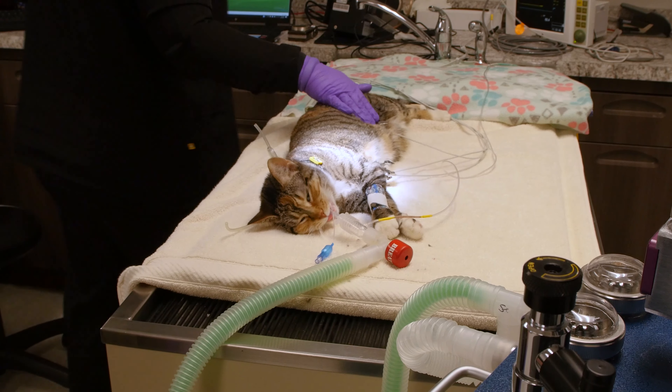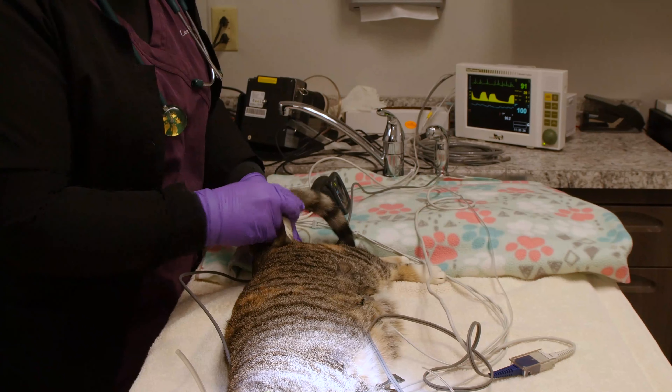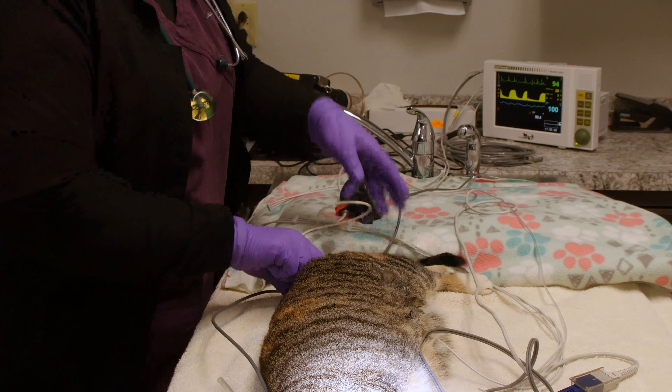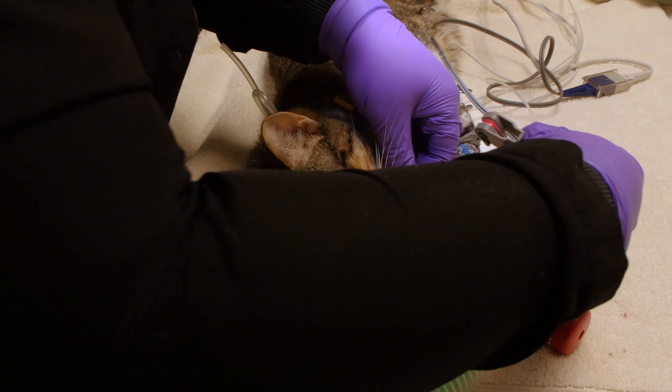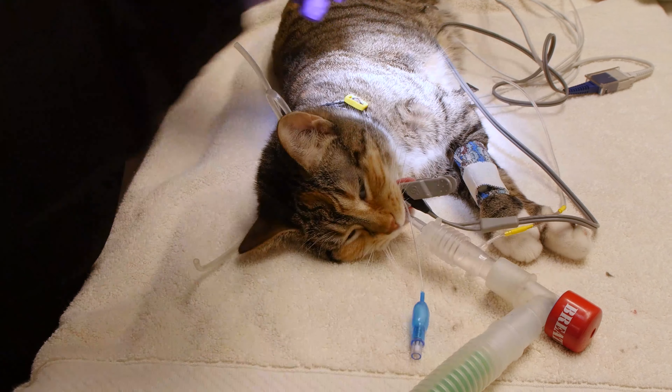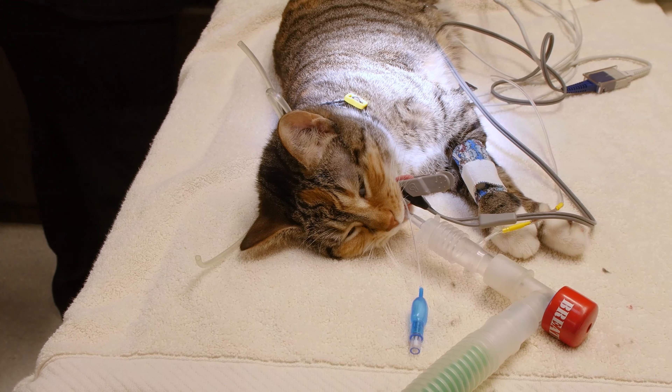We use an esophageal temperature sensor to monitor your pet's temperature during anesthesia. A blood pressure cuff is placed to monitor systolic, mean, and diastolic readings. A pulse oximetry with a lingual probe is placed on your pet's tongue — a non-invasive way to measure saturation of oxygen bound to hemoglobin, SpO2.